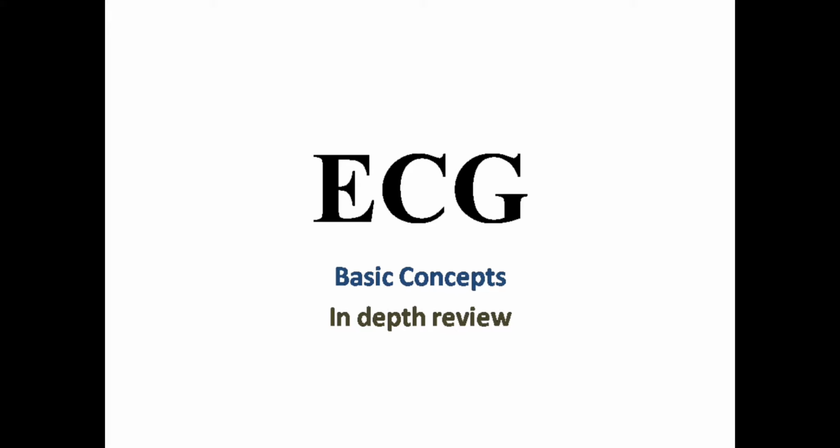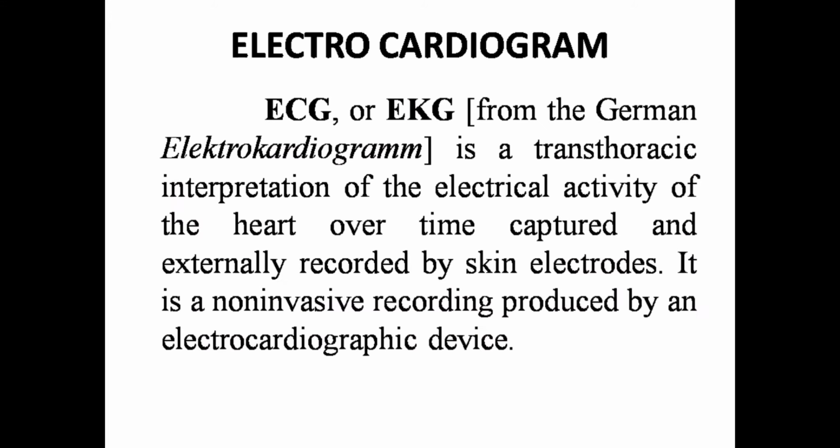So here we will see the definition of ECG. ECG or EKG came from the German word electrocardiogram, is a transthoracic interpretation of the electrical activity of the heart over time, captured and externally recorded by skin electrodes. It is a non-invasive recording produced by an electrocardiographic device.